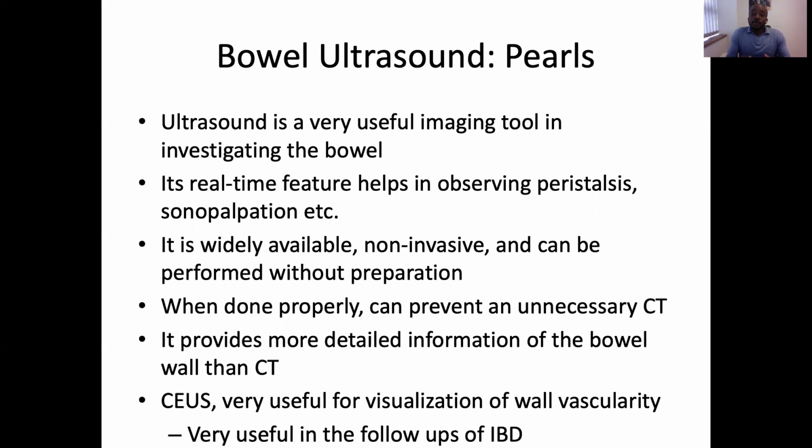operators and more specialists around in order to carry out the examination and report the images in cases of CT and MRI. In which ultrasound, once you have one well-trained specialist, sonographer, radiologist, or gastroenterologist, they can carry out the ultrasound right there and then and get the diagnosis, while even showing the patient what's going on, and it gives patients more understanding of the situation and the disease condition.